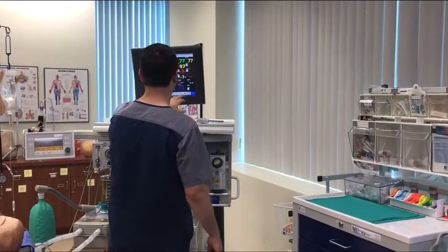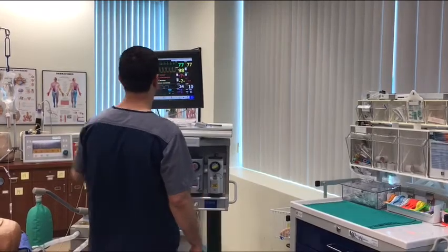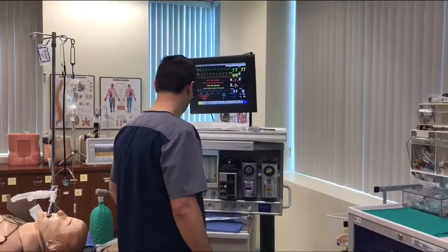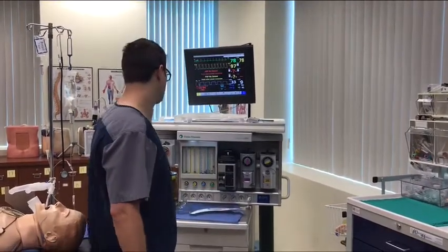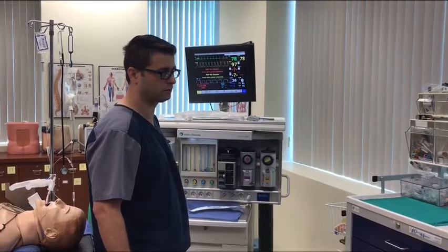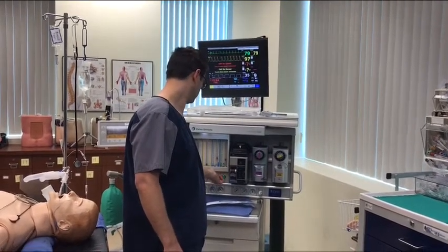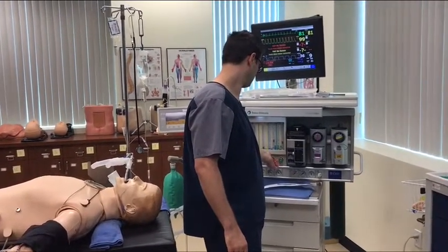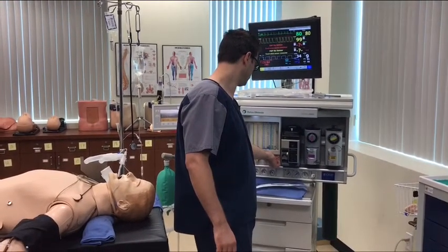Pre-oxygenate the patient. Bottom right. Perfect. The reason I say this: when you're emerging that patient, let's say I'm using a 50-50 blend of whatever. I'm going to make sure I turn that off, and fully saturate that FRC prior to extubation. Just like prior to intubation, I want to have that tank full in case something happens on extubation, right? And you're going to check that it's full by the end-tidal oxygen.